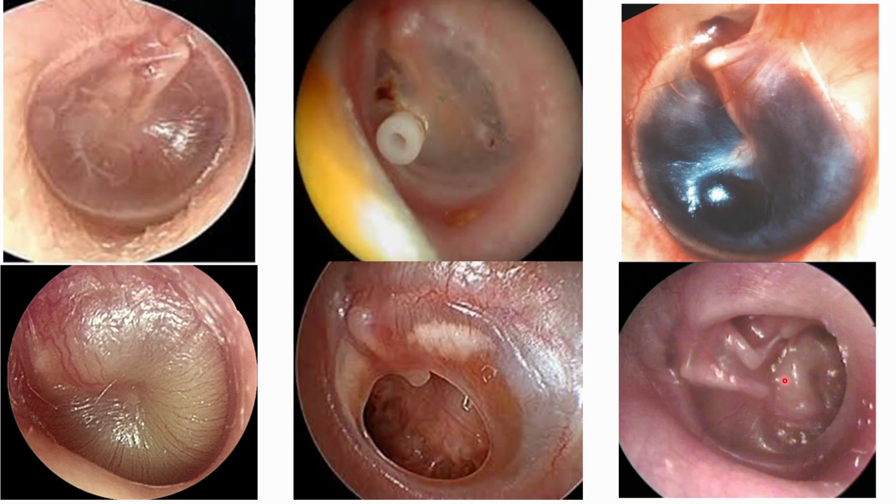And this also, because the volume is increased due to extra space. So external canal volume will be raised in this one. And sometimes definitely it is difficult to differentiate whether it's a perforation or adhesive otitis media.